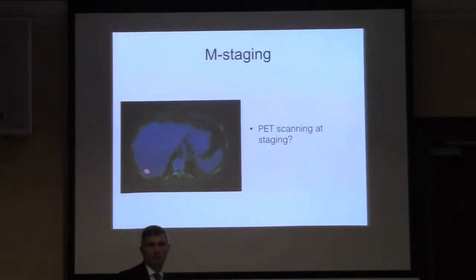I suspect that it won't be where we go in the future, because we know that PET scanning will miss a significant number of low metabolically active disease, so mucinous, poorly differentiated tumours, and also small volume disease, so it may miss some important nodal disease. So probably not PET scanning.